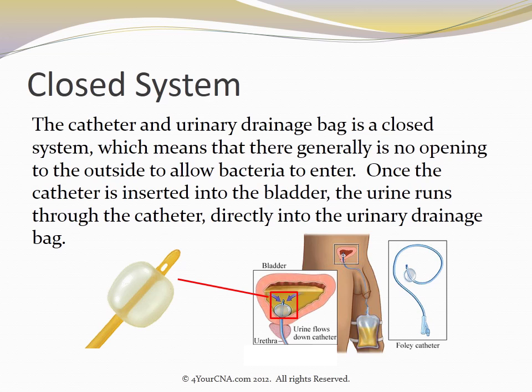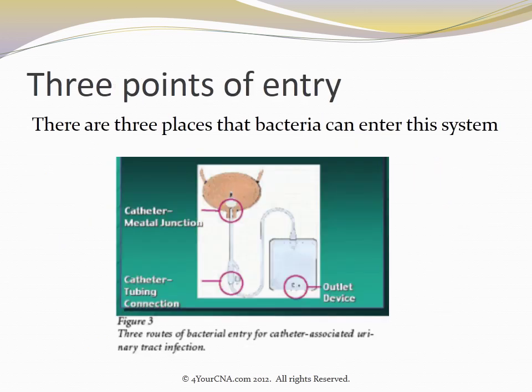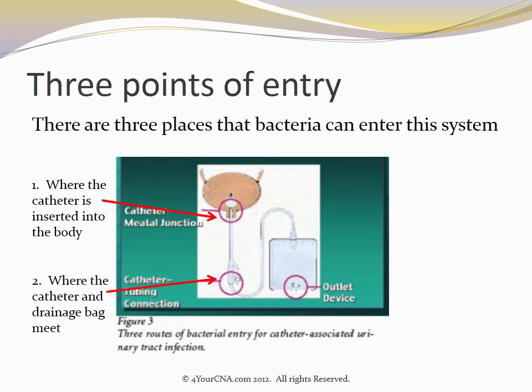The catheter and urinary drainage bag is a closed system, which means there is generally no opening to the outside to allow bacteria to enter. Once the catheter is inserted into the bladder, the urine runs through the catheter directly into the urinary drainage bag. There are 3 places that bacteria can enter this system: where the catheter is inserted into the body, where the catheter and drainage bag meet, and the emptying port of the drainage bag.